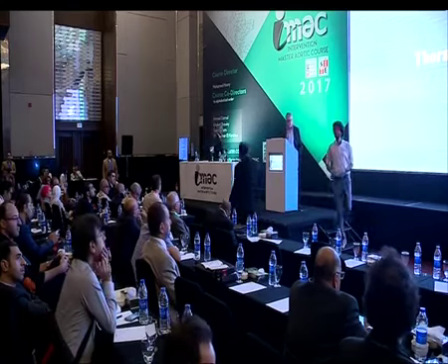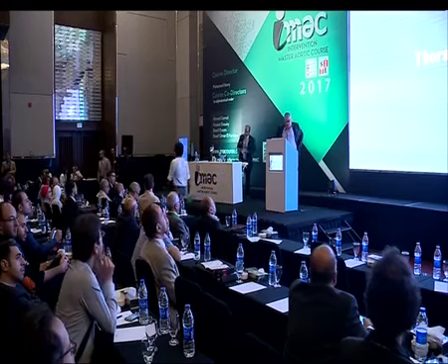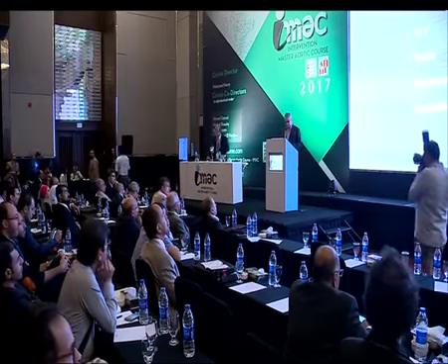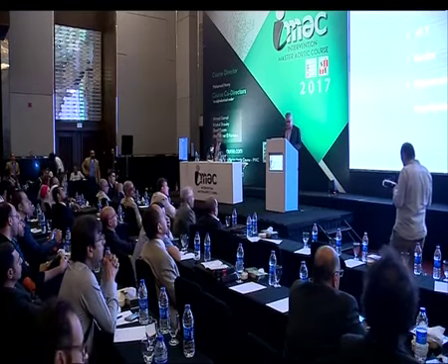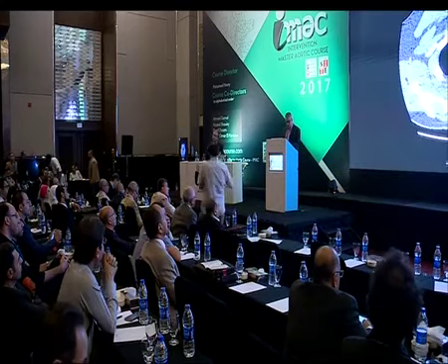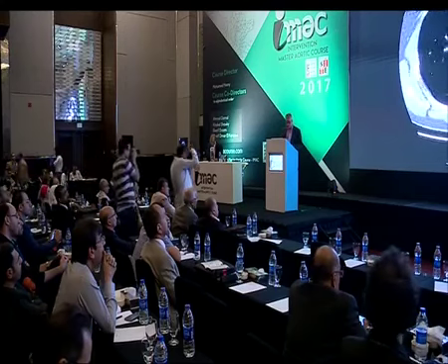Today I will share with you a thoracoabdominal aneurysm case. The patient is a male, 65 years old, with classic risk factors. Okay, this is the preoperative CT scan.